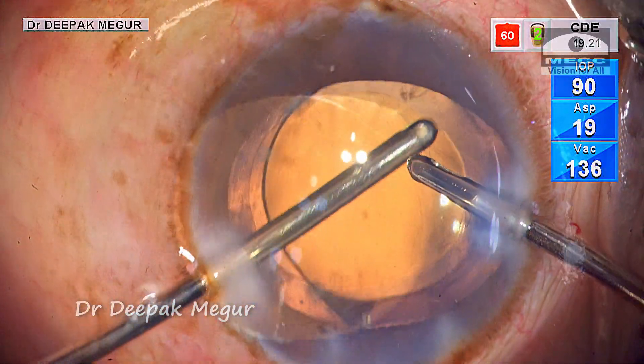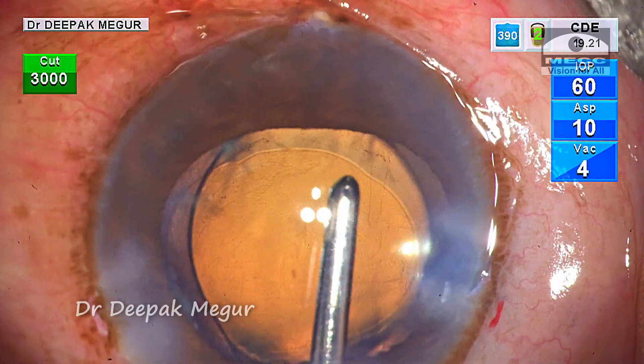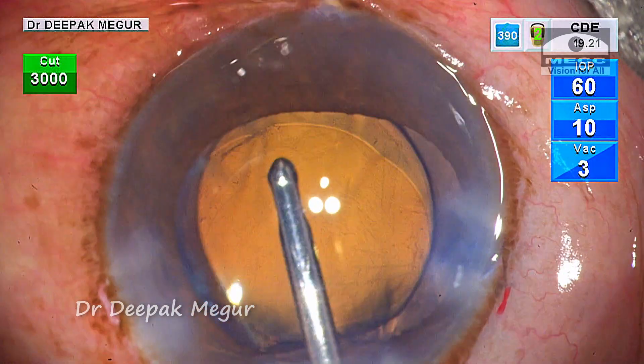I can see blobs of viscoelastic — an oily-like appearance — in the vitreous cavity behind the lens. So we have irrigating fluid which has gone behind, and also OVD which has traversed across the loose zonules into the Berger's space.